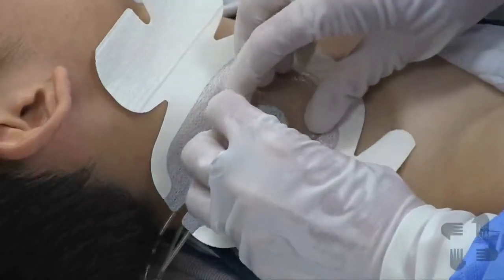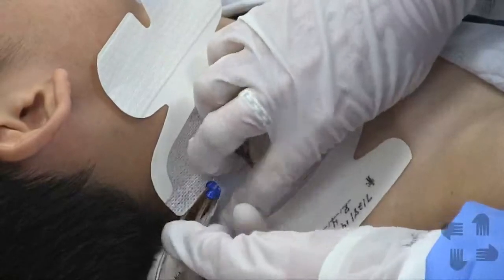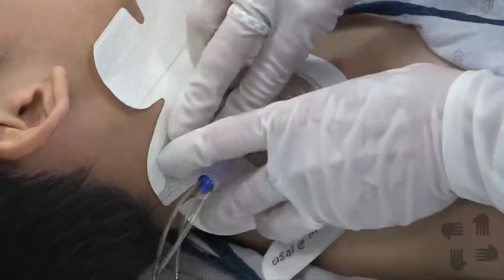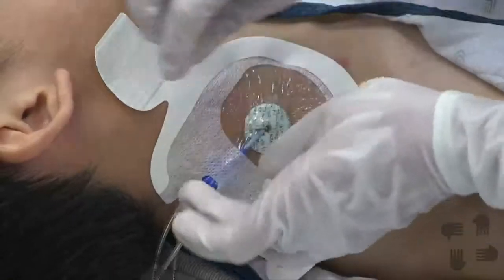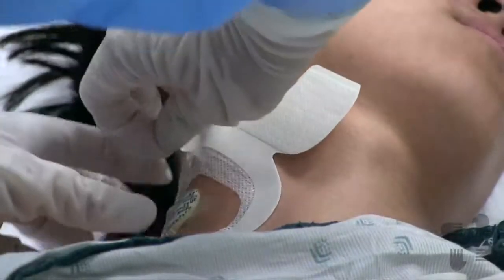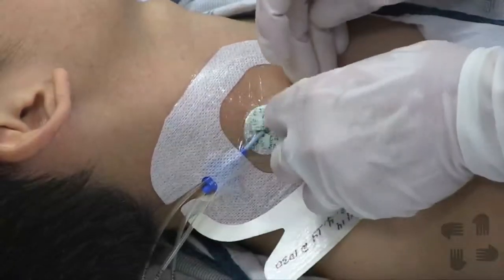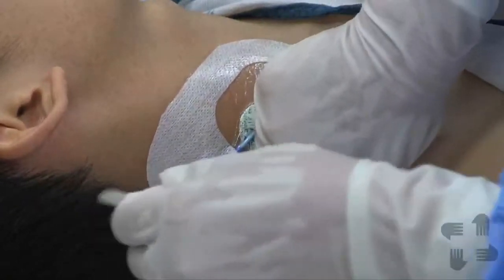Going to secure it in the center first and work your way out. Going to make sure the lines make it through the notch, like that. Once it's secure to the patient, I'm going to take off the right side here, which will later be placed at the top of the line to secure it. And then the second portion has the date that will be placed last.